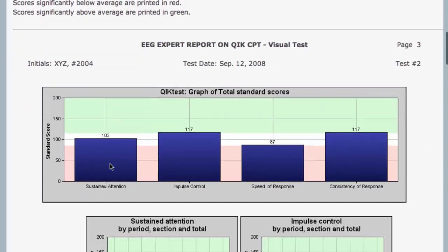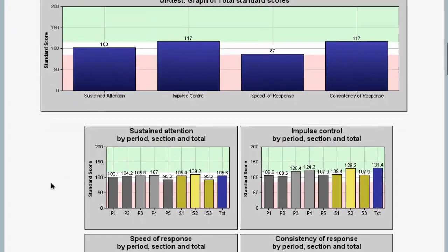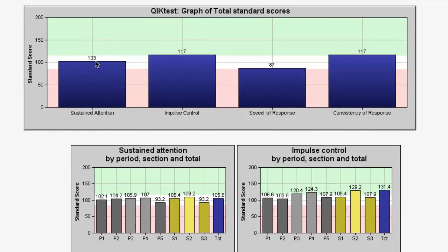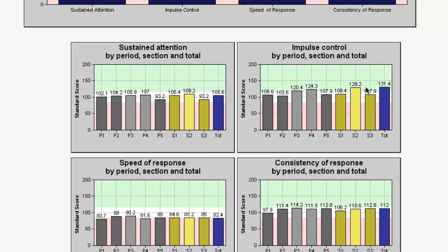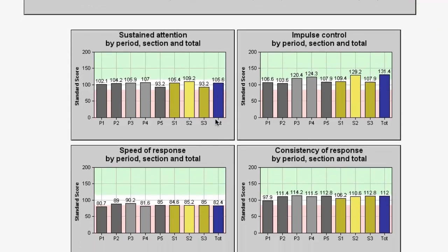The next section of the test breaks these same numbers down into pretty graphs. They look great to print out and give to the client. There's the standard score for sustained attention, impulse control, speed of response, consistency of response, and so forth. We take the same numbers broken down by period, section, and total — just a graph of the numbers that we already saw.